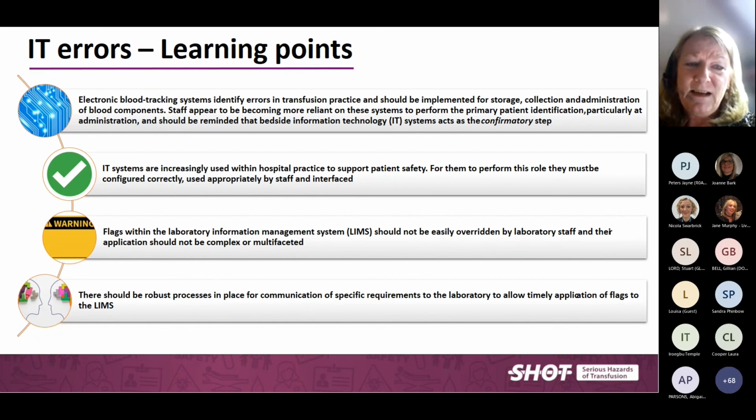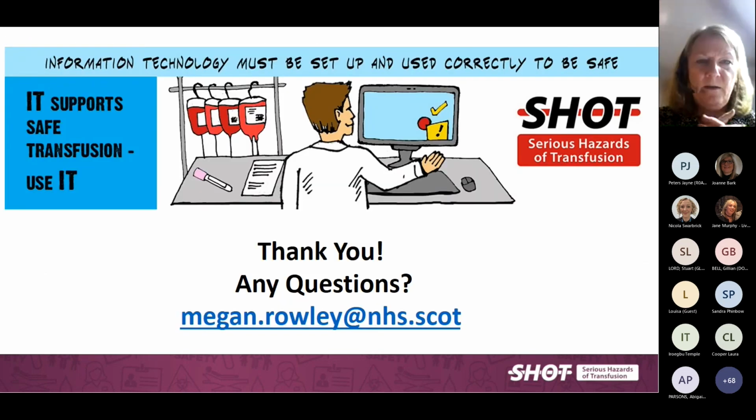The second thing is that IT systems are increasingly used to support patient safety, but they must be configured correctly and used appropriately and interfaced, and people must be trained. And the flags, which I've mentioned already, should not be easily overridden, and their application should not be complex or multifaceted. They should help the way we do things. And there should be a robust process in place. SHOT has just issued a new safety alert about specific requirements, but in the laboratory there should be a timely way of updating flags and making sure that they're in place. So that's really all I want to say.